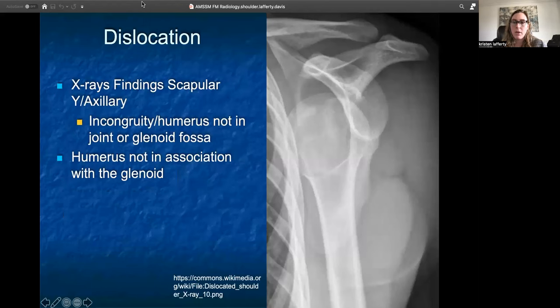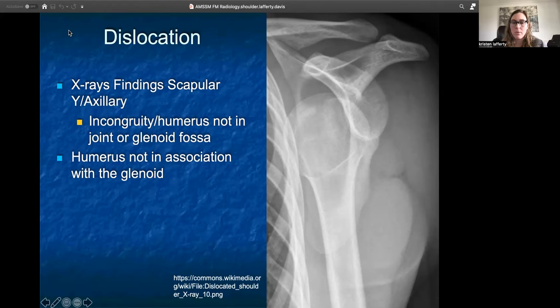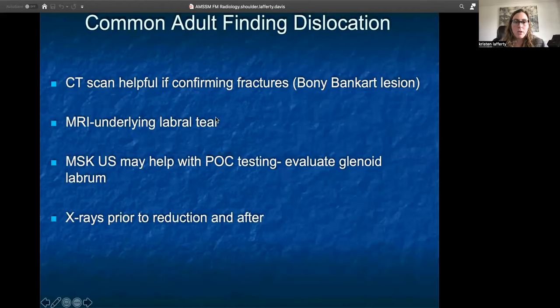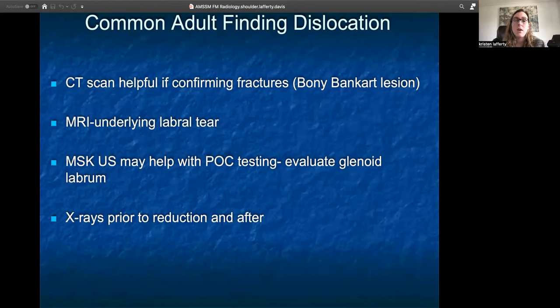The most common x-ray we really want to look at when suspecting a dislocation is your scapular Y or an axillary view, because it shows the relationship of the humerus and the glenoid really well. Here, the humerus is clearly not congruent with the glenoid, so we are looking at a humerus dislocation. Important to note that you can't always see fracture findings on x-rays, but if you suspect one — perhaps because of some locking or catching of the joint after a dislocation — a CT scan can be really helpful in confirming those fractures. In some dislocations there is certainly sequela: folks can tear their labrum, which is a bit of a suction cup for the glenoid and the humerus. If a labral tear is suspected due to significant instability or really bad pain ongoing after a dislocation, an MRI arthrogram would be really helpful in diagnosing that.